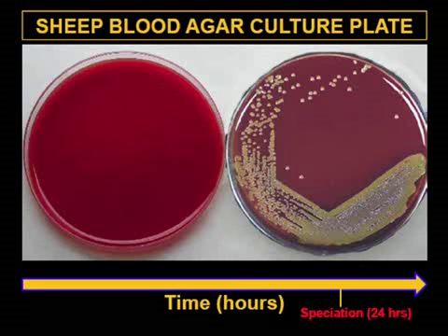Culture is dependent on the growth characteristics of the organisms. Therefore, if you have the wrong media or the organism is fastidious, has a slow growing time, you have to wait until it achieves the appropriate amount of pathogens to show up on the culture to allow for speciation. In this case, on average, speciation can occur 24 hours after sample collection.